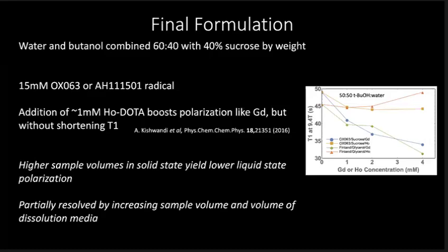Over here, I've shown a plot of how the T1 depends on the concentration of the gadolinium or holmium DOTA, and you can see the holmium DOTA, this upper curve here. You don't see so much the suppression of the T1, so that holmium DOTA is behaving as it should.